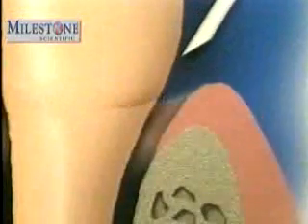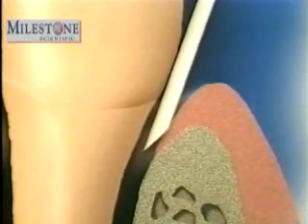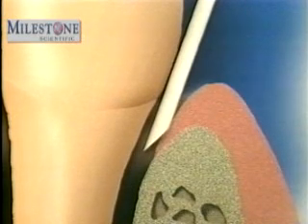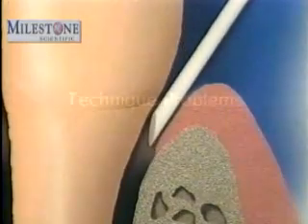Here are some common technique problems. The needle bevel is not facing towards the tooth. If the bevel doesn't face towards the tooth, the injection will not work as well, and for the patient, it'll be a lot more uncomfortable. Have the bevel facing towards the tooth.